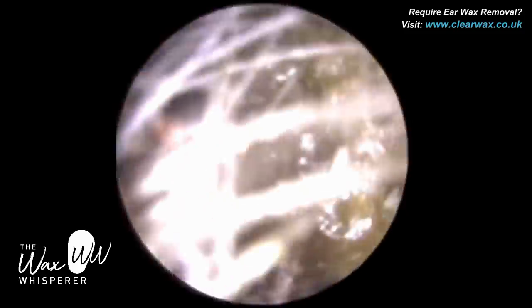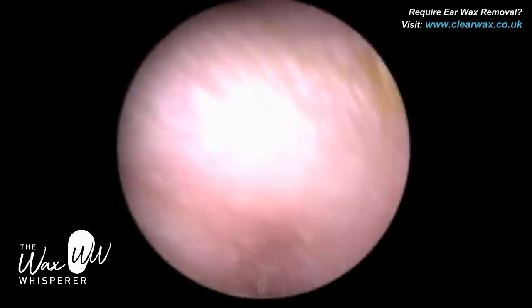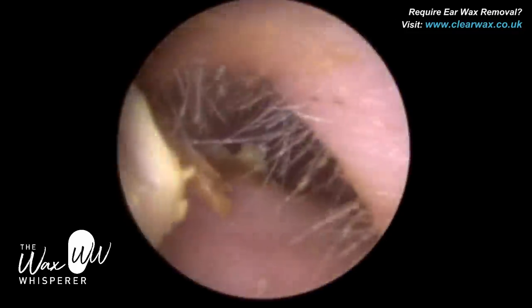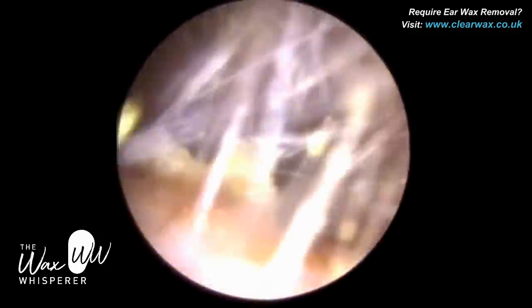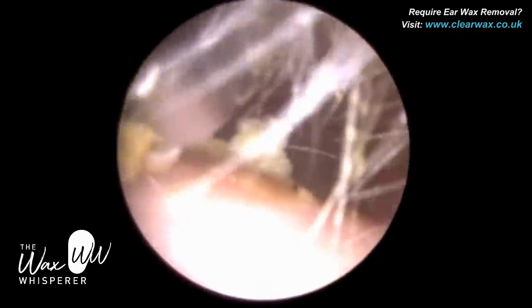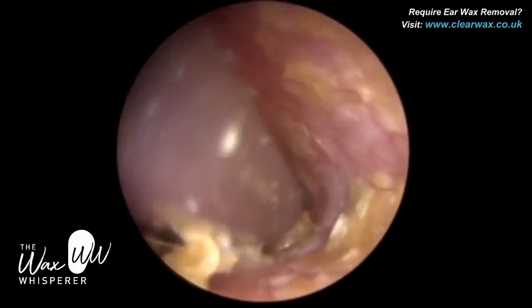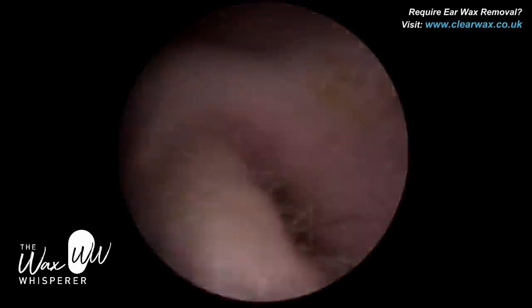We're now at the entrance and it's a fair size. I didn't measure it — sometimes in a busy clinic you just don't get time and it's patient after patient, so I apologise I didn't take a still image. The patient had been using loads of drops for about a week or two, so the ear canal is quite wet. I've gone back in with some microsuction, just mopping up the ear a little bit. It will dry up naturally and the residue will migrate.